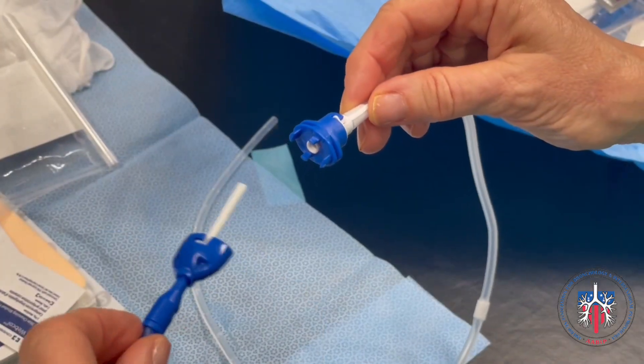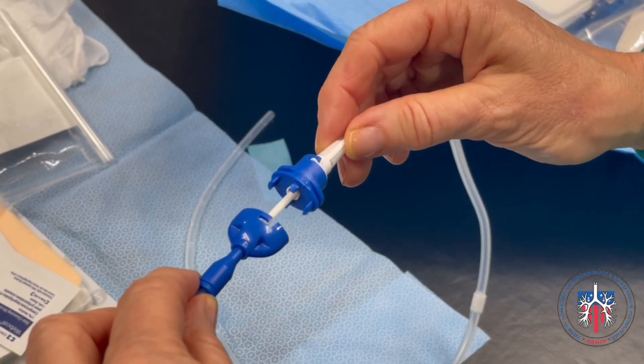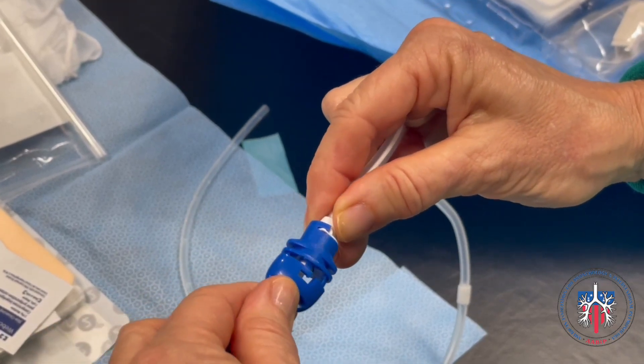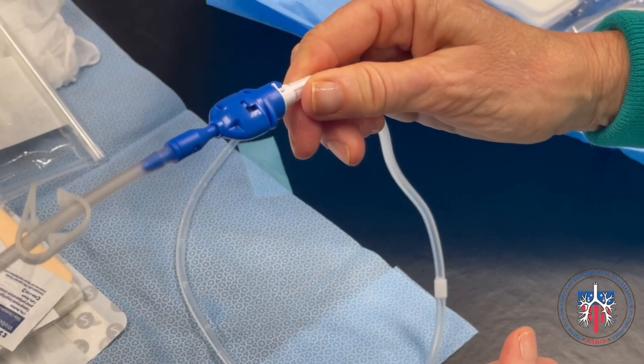To attach the Plurorex Catheter to the drainage line, simply line up and insert the drainage line into the adapter and snap the pieces together. The drainage line can then be connected to a chest drainage system. The Rocket Drainage Bottle can be connected to the Plurorex Catheter via the adapter in the same way.